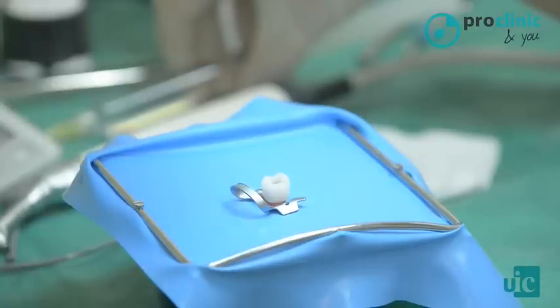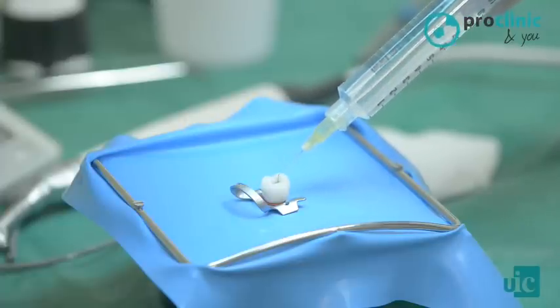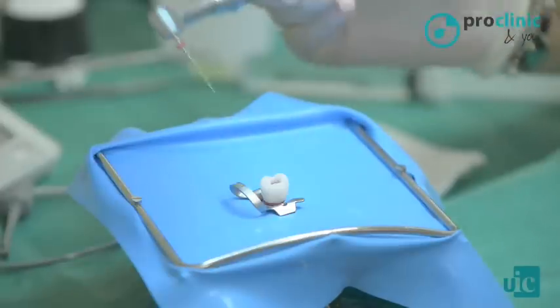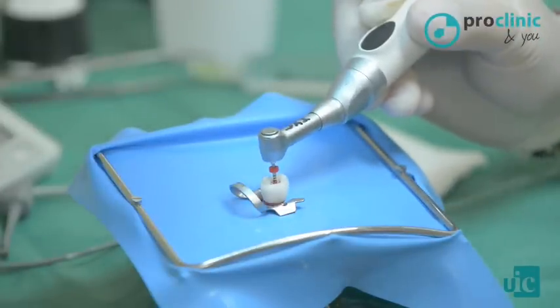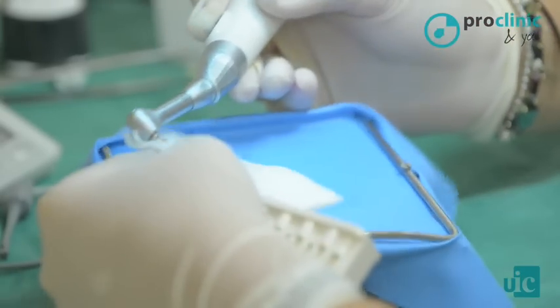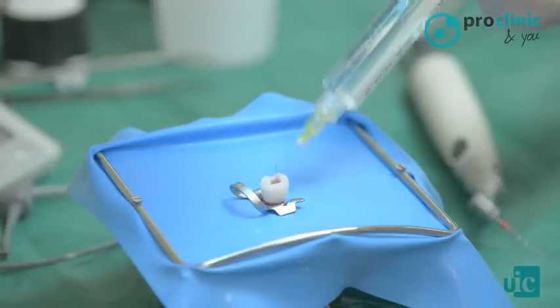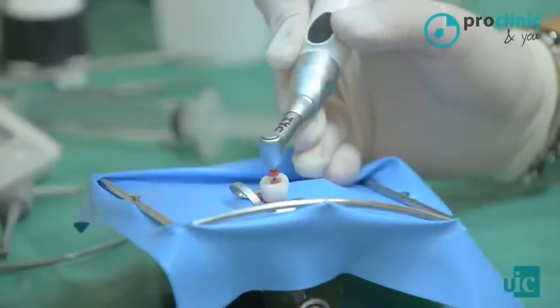When the master file is determined, we introduce the irrigation solution into the canal to lubricate the canal while we are using the file. We take our file and we set the rubber stop at the working length already established. We introduce the file inside the canal, doing 3 pecking movements towards apical. We clean the file with a gauze. We irrigate again. And we proceed to repeat the 3 movements till the working length.